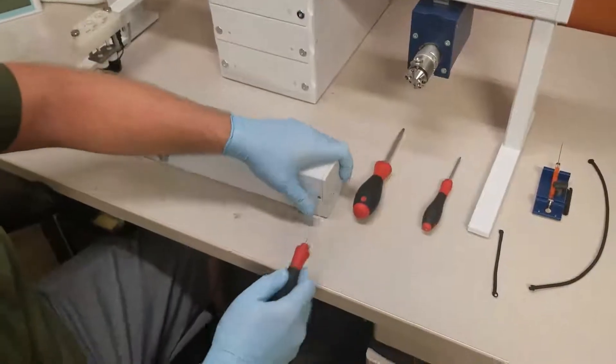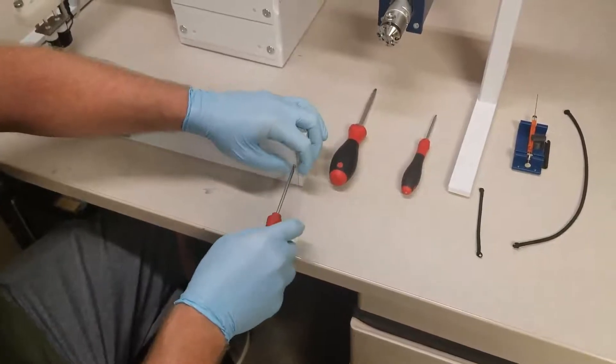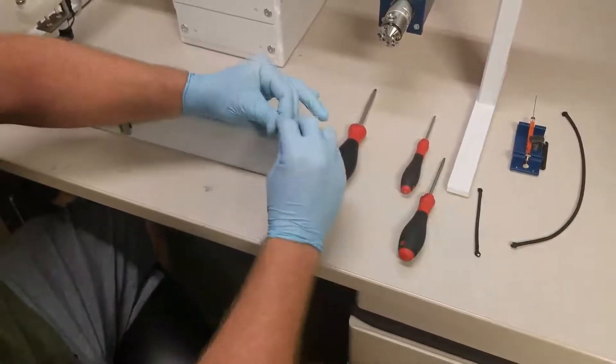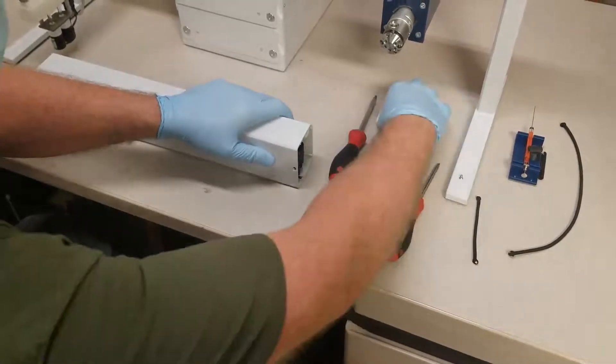So we will begin by taking a Torx 10, and removing the screw that holds the cap in place, and releasing the long tension cord.